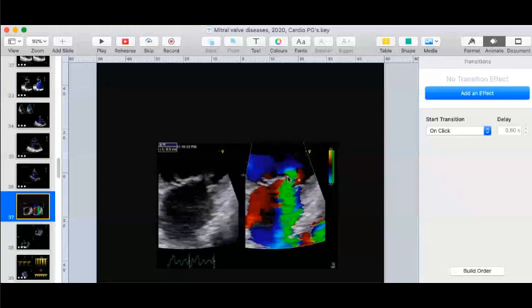And for a good vena contracta, you need to have a good convergence, you need to have a neck, and you have to have a divergence of the flow. So that is the other thing. When you're doing a vena contracta, make sure that you have a good convergence here, and a small, good, nice neck, which can be delineated using the zoom. And then you have the divergence of the flow as it enters into the left atrium. So that is important. Now, what method is this?